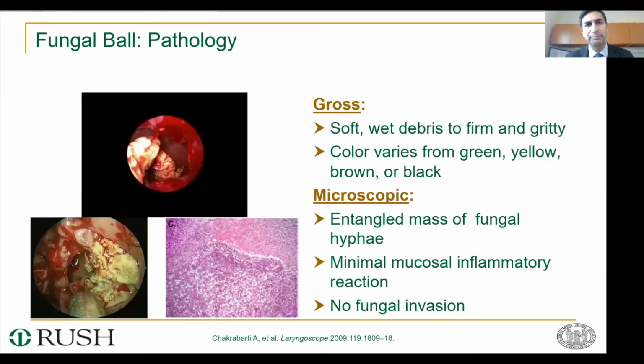So again, I'll focus on the pathology of these many variants, looking at a fungal ball, showing you endoscopy of a fungal ball removal during surgery from the left maxillary sinus. You can see that grossly the appearance can be soft, wet debris. It can be very firm and gritty, and the color can really vary anywhere from yellow, green, brown to even black.